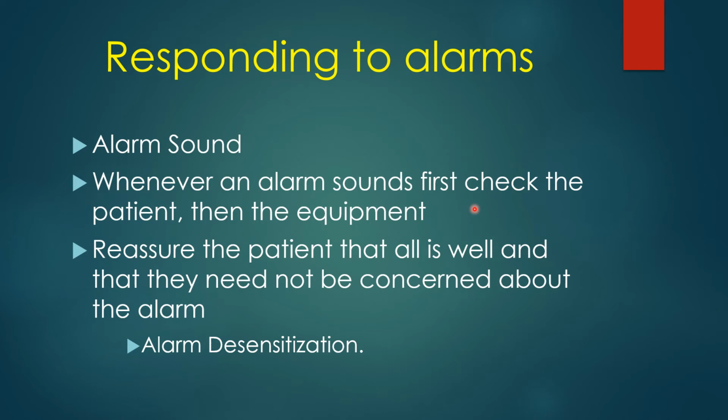And I discovered that the expiratory valve inside the ventilator was stuck, and so the patient could not exhale. So in this situation, it was the ventilator, not the patient, but everybody was blaming the patient. So just remember that it's the patient and the ventilator, and either end could be the problem. Start at the patient and work toward the ventilator.